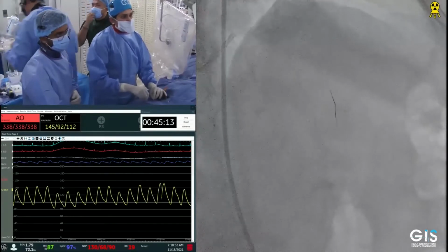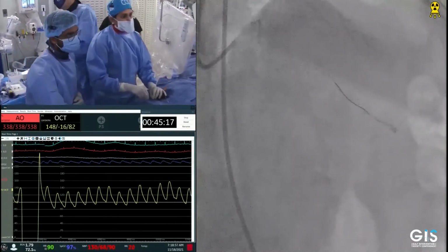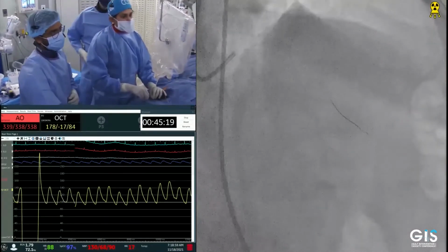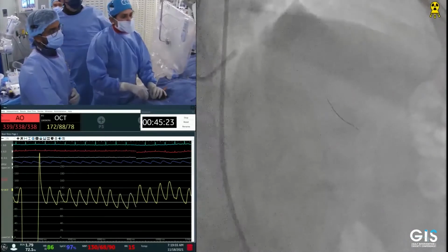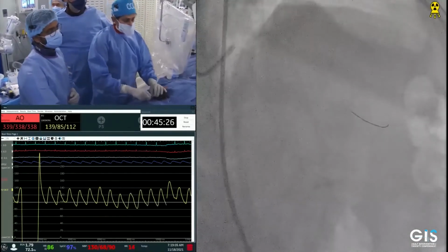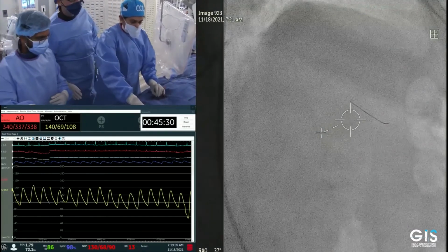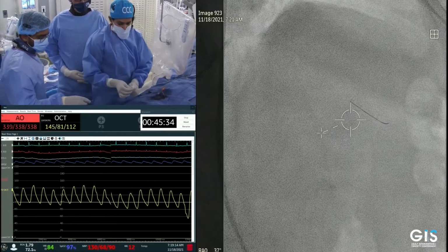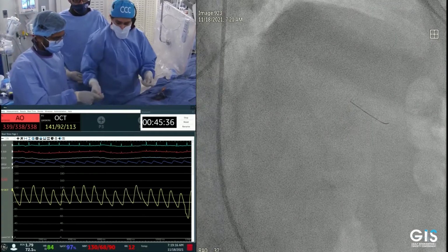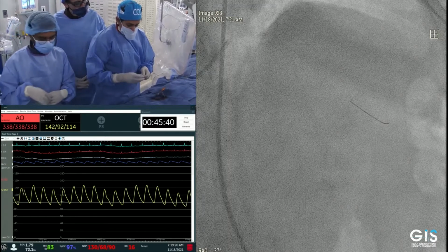I think we can put the stent, the LAD. Put a stent in the diagonal, a short stent, and then do a stent for the LAD. That's it. If you have imaging, it shows the extent of the lesion, which is important, to see whether it extends distal to the diagonal or proximal to the diagonal. So if you have the facility of imaging, I agree. If you don't have the facility of imaging, I don't think most of the audience here uses OCT frequently.